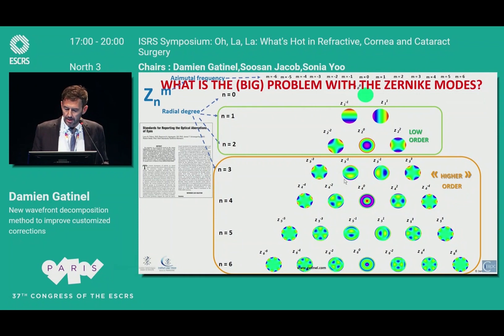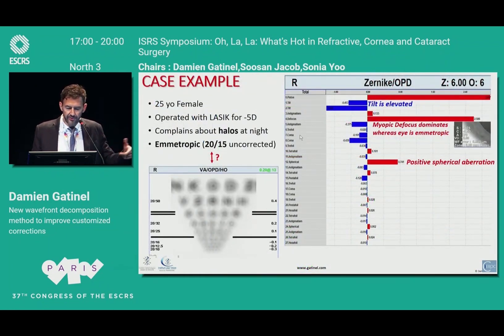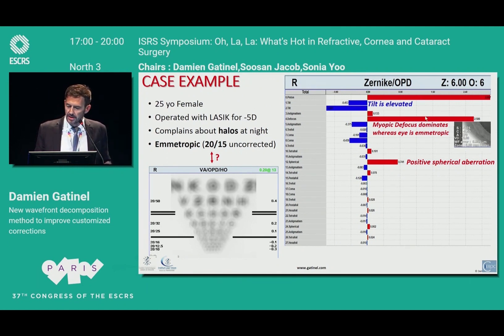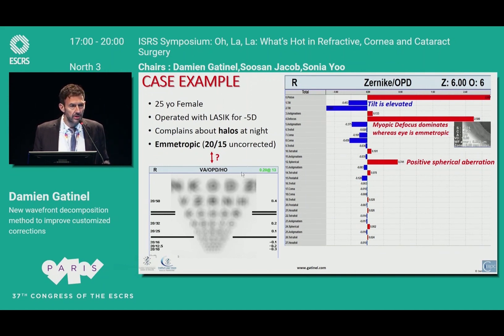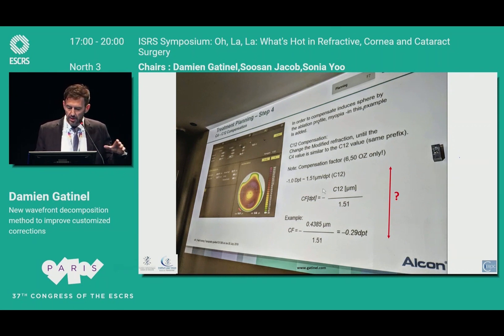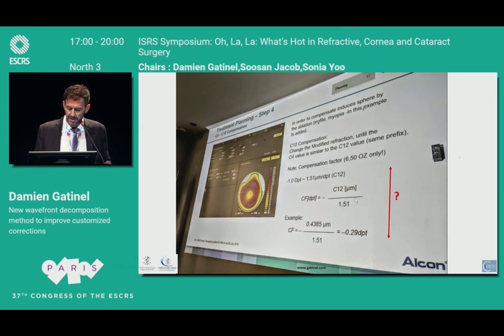This is probably more obvious on this example. You can see that this patient came for LASIK, was 20/15 uncorrected, but the wavefront analysis showed some myopic defocus, of course lots of positive spherical aberration, lots of tilt, and an unrealistic image prediction for someone who is 20/15 based on higher-order aberration alone. You also know, for those who use some platforms, that you have to compensate some modes of correction when you have C12 adjustments or when you play with asphericity.